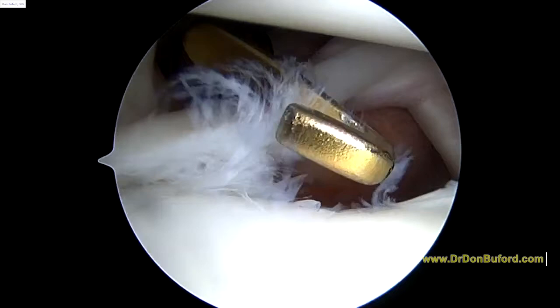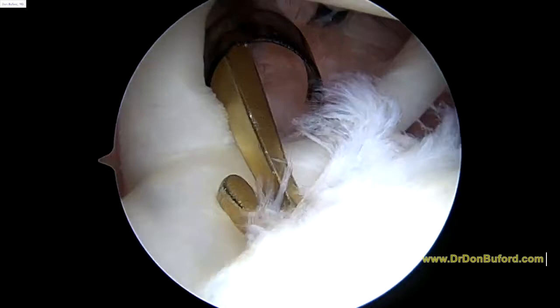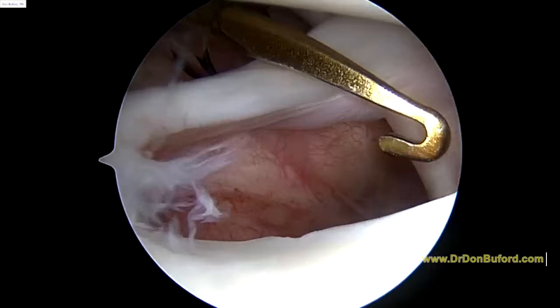Coming off of this, we've got the middle glenohumeral ligament right here, and it's attached right into the base of the biceps. A little bit of labrum here, but this is basically what we used to call a Buford complex. And that's one of the issues that we'll be able to stabilize by placing an anchor in right about here. So we're going to stabilize this middle glenohumeral ligament. You can see how this is not stable because the whole biceps anchor is unstable.